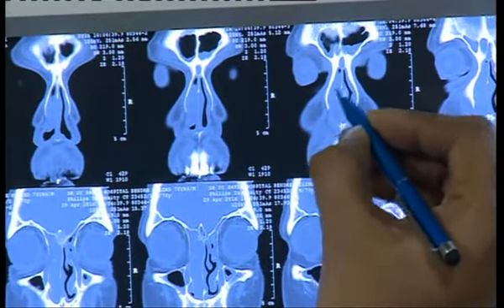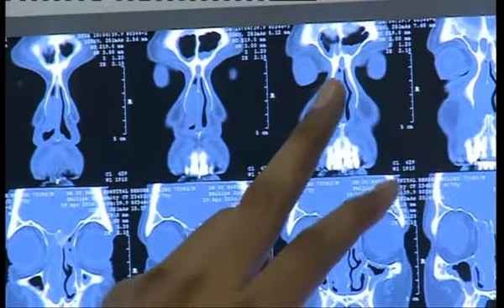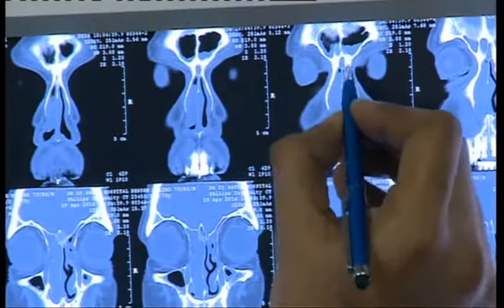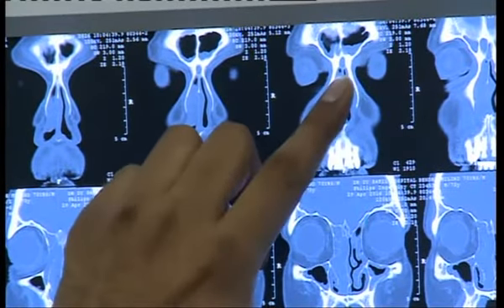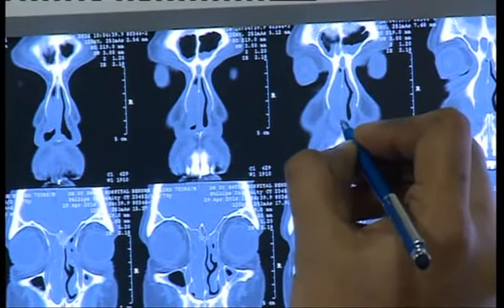See the well developed frontonasal processes. These are two frontal sinuses, which I said have partial opacification. This is again to me the intersinus septal cell coming up, and this is the opacification on this side.